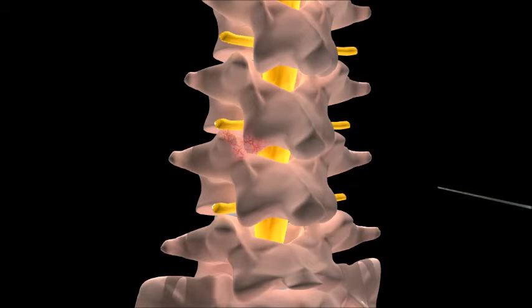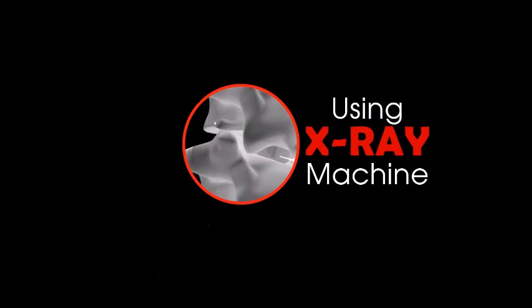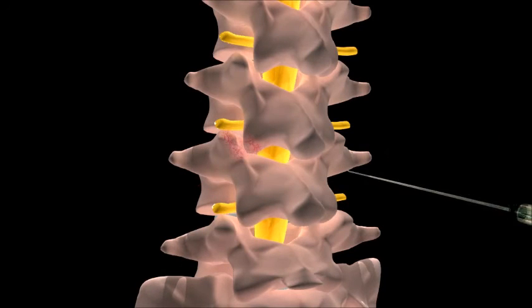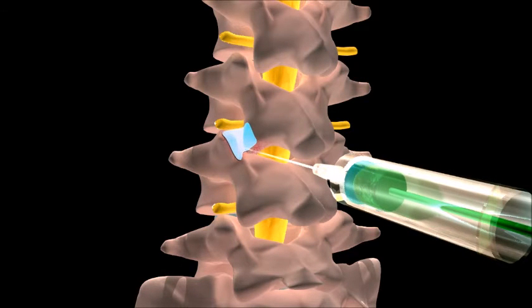He will then use a special x-ray machine to guide the needle accurately into the lumbar facet joint. A mixture of local anaesthetic and steroid is injected slowly into the joint.